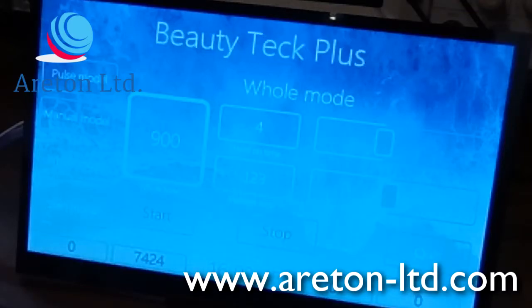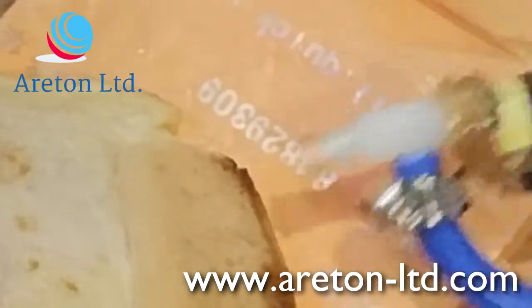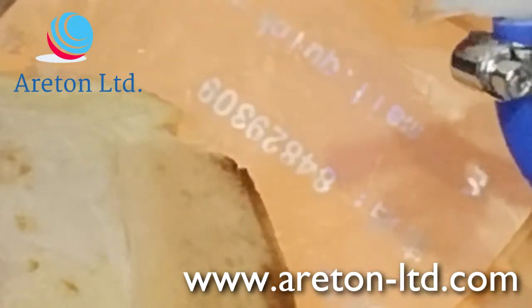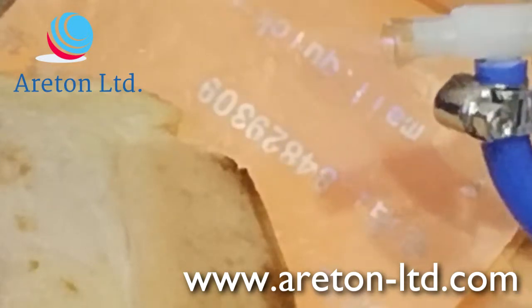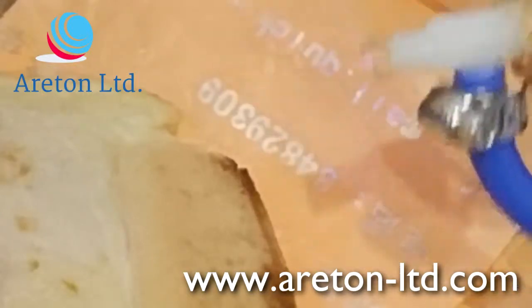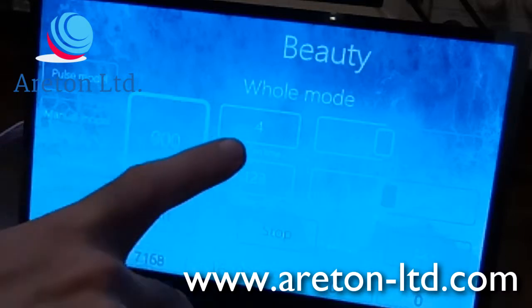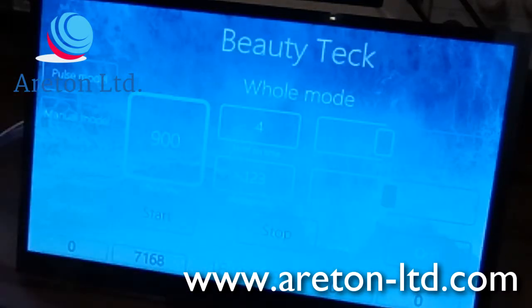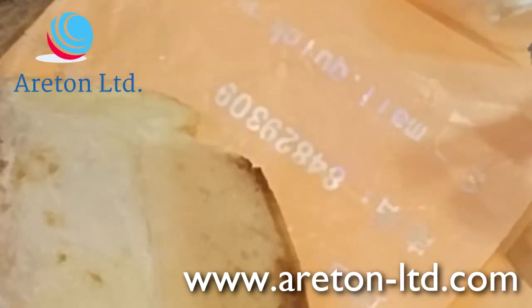A tiny bit, and it's still on. Then a tiny bit, it's still on. Then another tiny bit, and it's still on. So it's set up almost properly, but there are some settings that we've got to change on this device in order to detect the arc properly. But look at this. The wait time is 4 seconds, and the hold time is 900 milliseconds. I'm going to show you some bursts, to see how many we can actually produce.